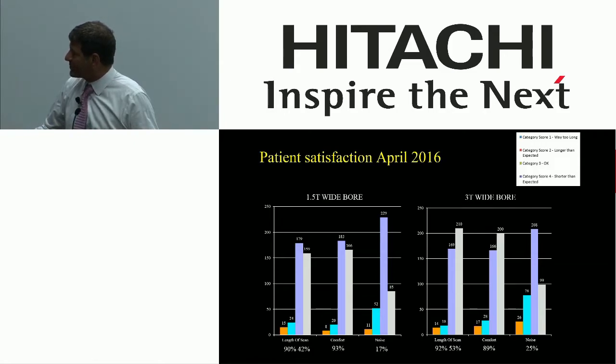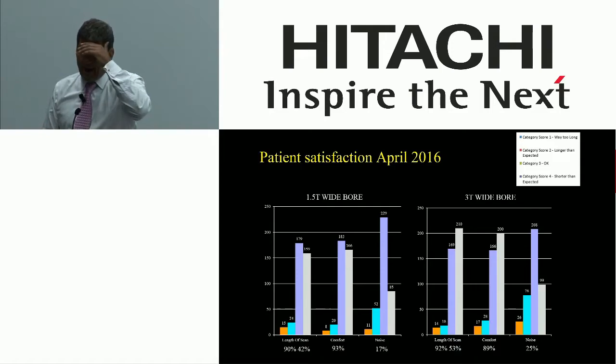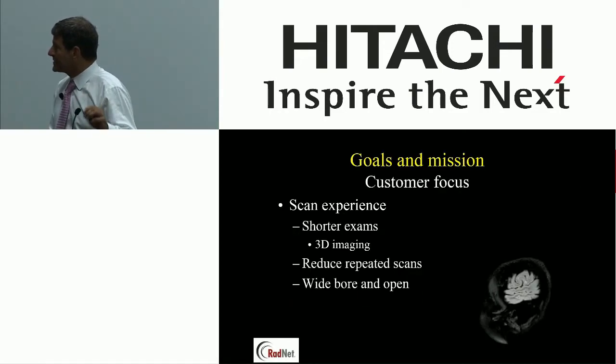I got 53% of the people on the 3T say the exam is shorter than they expected. Okay? 53% say it's shorter than expected, considering that the exam is actually louder and hotter. So a little bit of speed makes a difference, and patients perceive it.